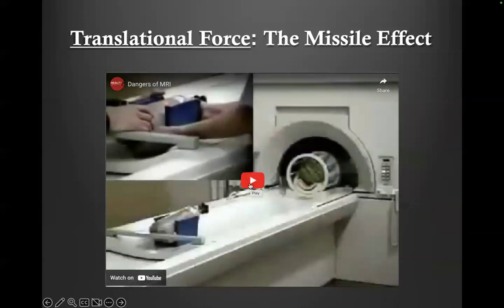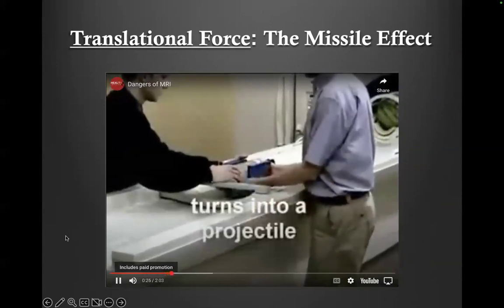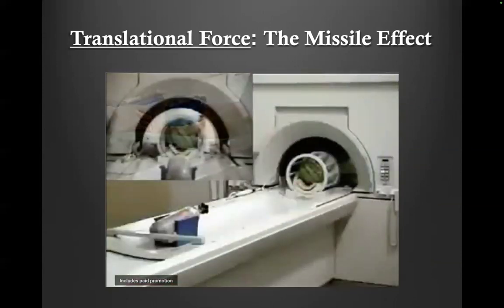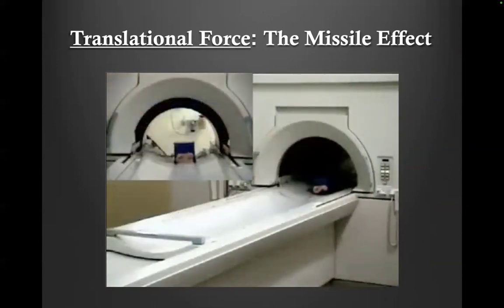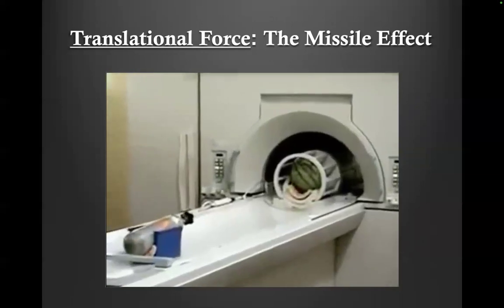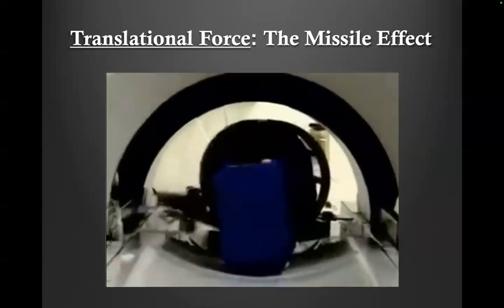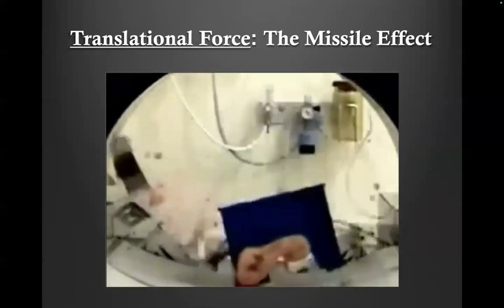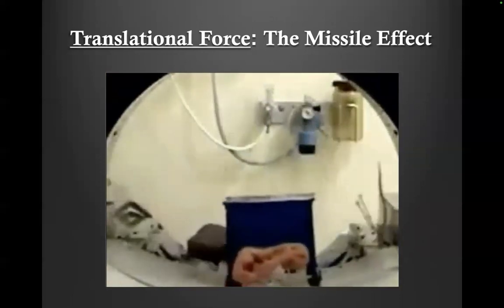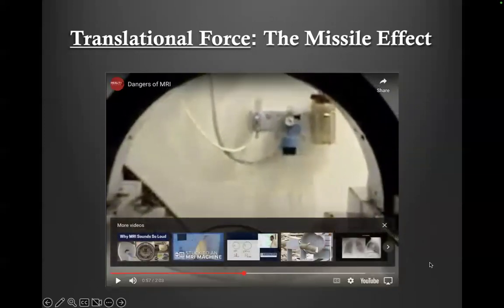So this is another video that shows you how strong the force on a small oxygen tank is going to be. Hear the sound? That's actually the chirping sound. As the magnetic field quickly rises as you get closer to the center of the MRI, this projectile motion is also going to accelerate really, really fast. So that's pretty horrible.